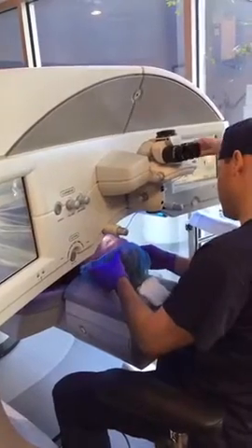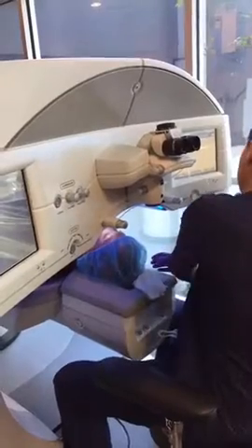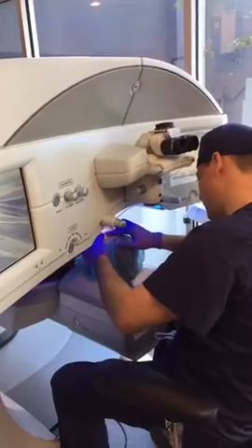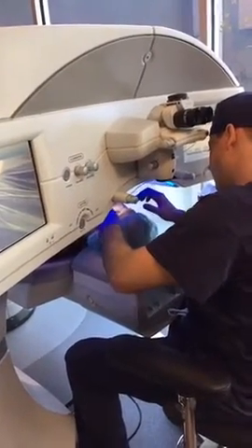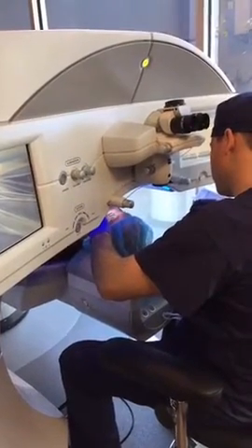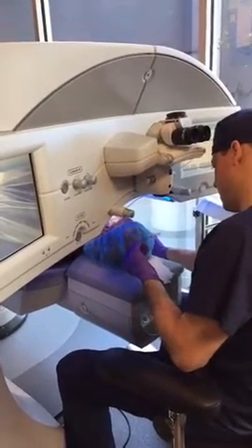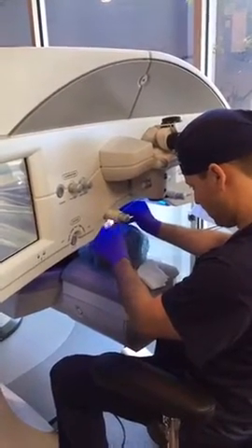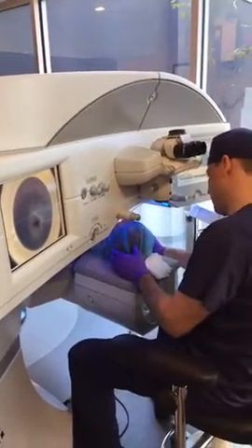Okay, so I'm going to rotate your head slightly this way, and then chin up just a smidgen. Okay, so same thing here. You'll see that bright ring in the middle. The green light's not blinking yet, but it'll start here in a few seconds. This is that eyelid holder. I know that feels kind of weird. So just look up there, see if you can find the center of that white ring. And then momentarily, the green light will begin flashing again. Great job. Just look for that green light in the middle of the ring now. Looks beautiful.